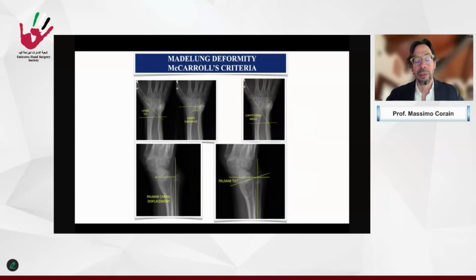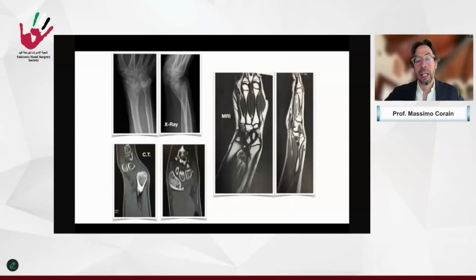Then we can obviously have a CT to understand in a better way the pattern of the deformity, and the MRI for the soft tissue, like the Vickers ligament.